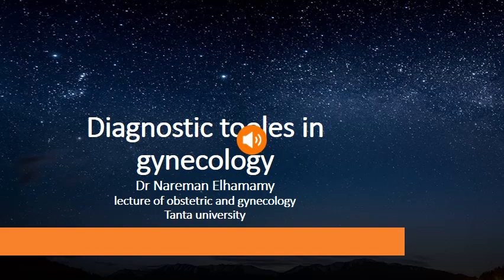Regarding the colposcopy, it is a stereoscopic binocular low power microscope. It's a difficult name, but you can simply say it's a microscope that permits 6 to 40 power magnification of the cervix. The colposcopy is used to examine the lower genital tract, but it doesn't enter the vagina as its focal length is 20 centimeters. Another thing is the exfoliative cytology, the study of the individual cells which shed from the surface of various epithelial types, and we will examine it by the pathology.